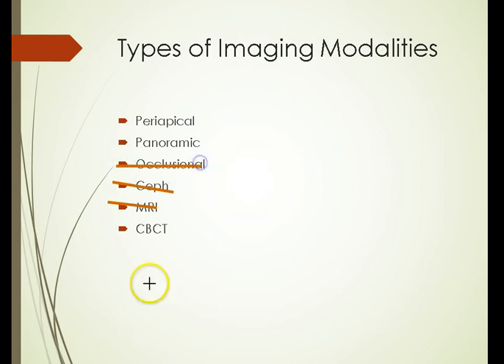So that leaves us with periapical, pan, and cone beam CT scan. Obviously, the cone beam CT scan is the most reliable, most accurate, and it's also a good teaching tool for the patient. But there's a history of doing implants with periapical and panoramic. Obviously, they have their limitations, but with the right technique, you should feel very comfortable working with periapical and panoramic and get excellent results without compromising the patient's health and success.